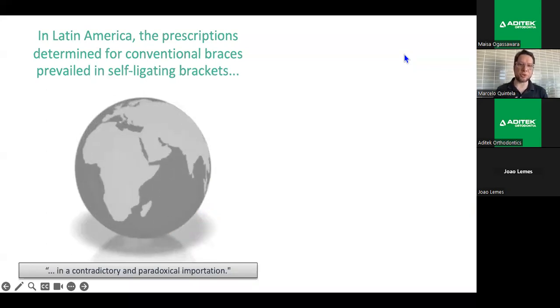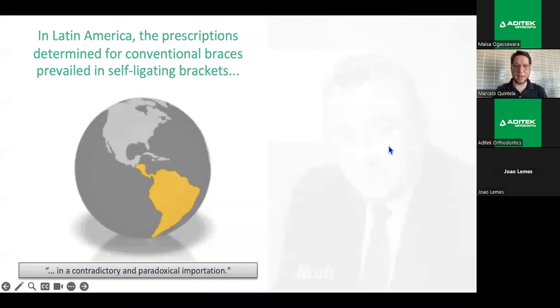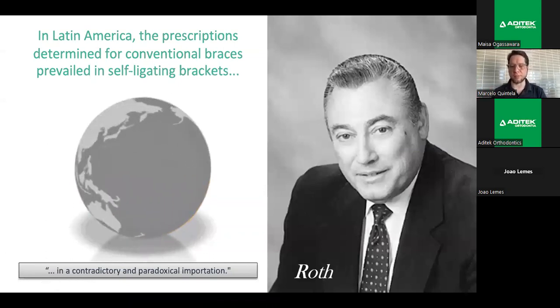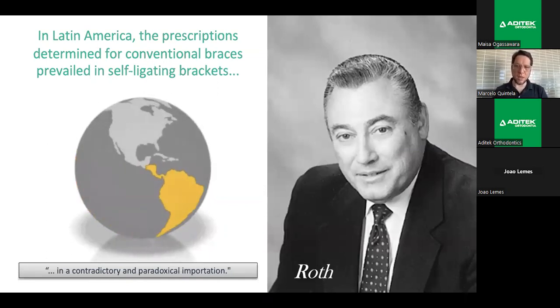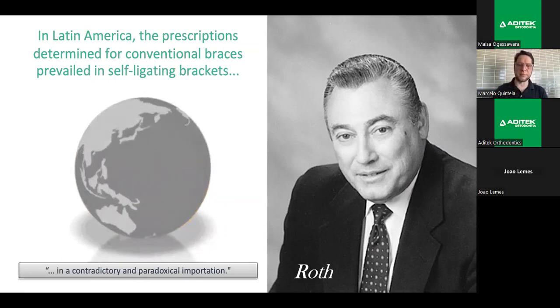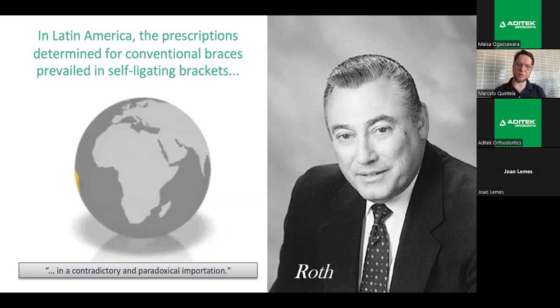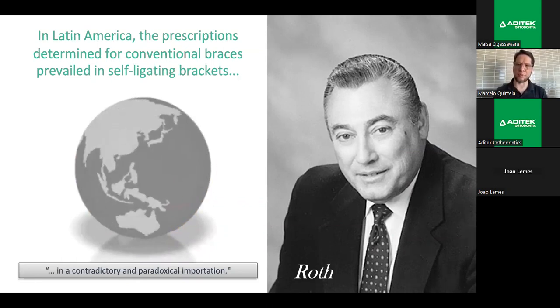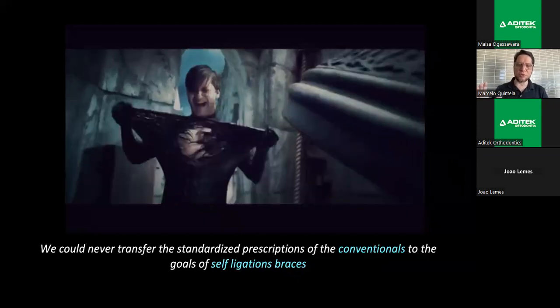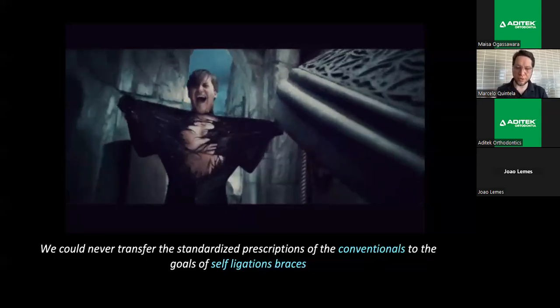So in Latin America, the prescriptions determined for conventional braces prevailed in self-ligation braces. And the principal prescription that prevailed was the prescription of Professor Ronald Roth. And the Roth prescription, idealized for the conventional system and exported to the self-ligation system, is something so contradictory and so paradoxical. What it means is we could never transfer the standardized prescription of the conventionals to the goals of the self-ligation braces.